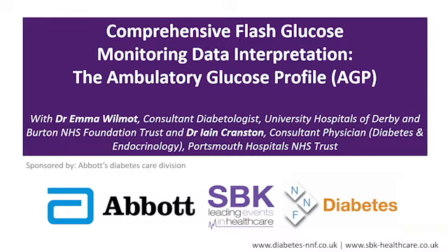I think when somebody is achieving, what we have to do is give control of the glucose conversation to the person. Say, are you happy with that? Or are there things that you would still like to discuss? I'm very happy to, but I'm quite careful, when people are achieving well, to just give them options to try rather than give them recommendations, because I'm not living that person's life. Giving hard recommendations to someone who's already doing well, in my mind, is much more likely to cause hurt than to cause benefit. And so starting with the numbers is that reminder to me not to get too bogged down in everything.